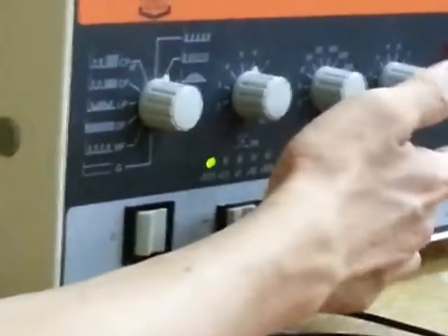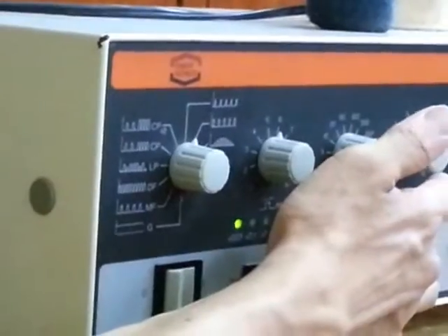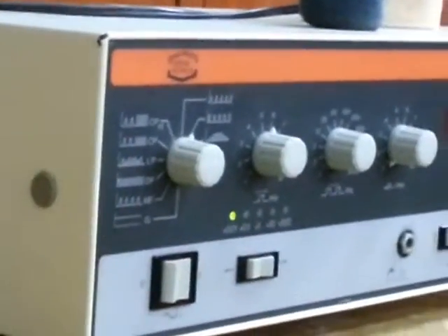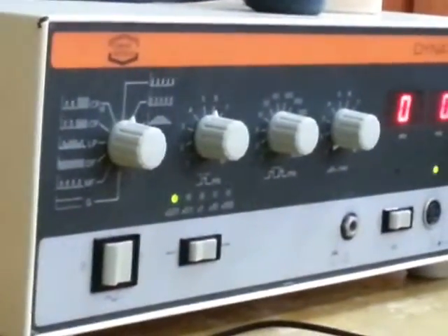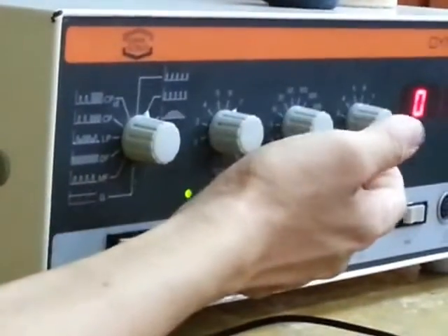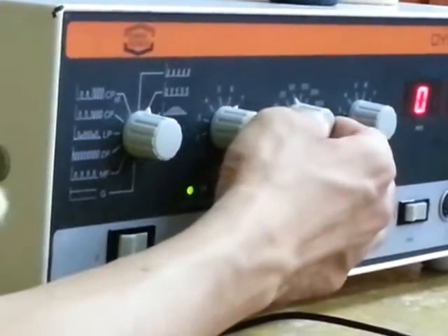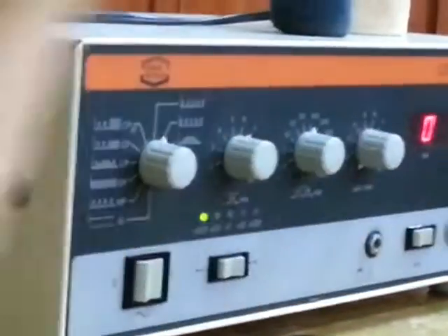So again, the duration of the pulse interval would be in terms of milliseconds. They usually prescribe 2 to 3 times the pulse duration. So if you have a pulse duration of 70 milliseconds, times 2, you would use 140 milliseconds.